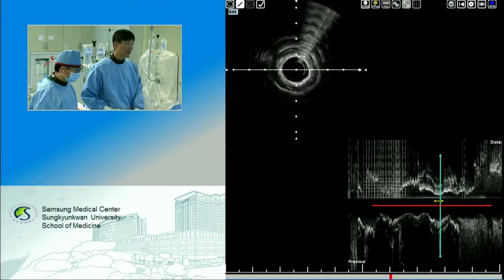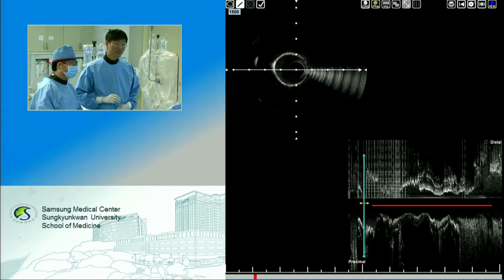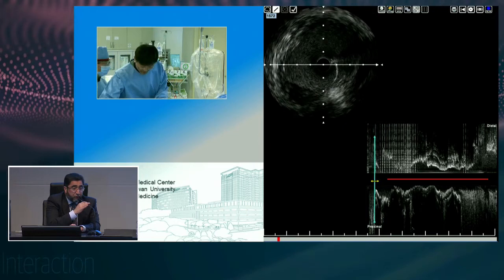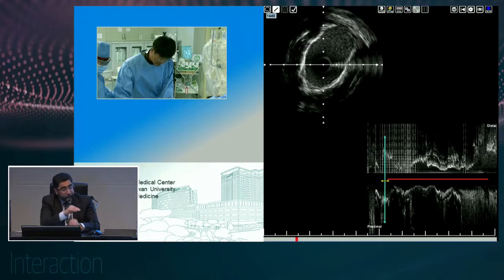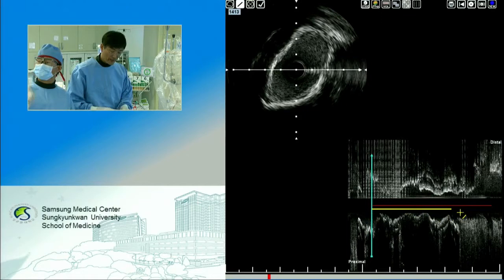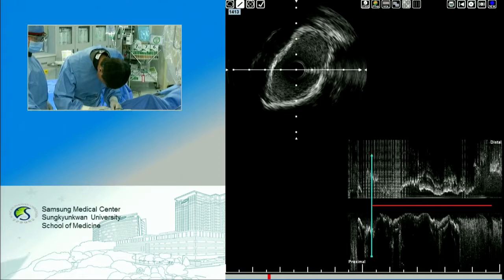I think you could upsize the burr, but one other option would be to take a compliant balloon at low pressure, and if it inflates nicely, then you probably don't need to upsize. If you see a significant waist on the compliant balloon under low pressure, then probably you do need to do more rotational atherectomy. Okay. Anyway, I prefer to upsize the burr. Okay, there is a risk, but the vessel size is 3.0, there is no disease at all, so I prefer the stent full expansion.